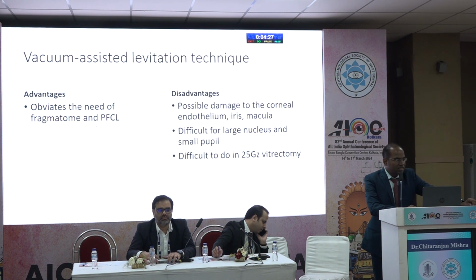So what are the advantages? It obviates the need for fragmatome and PFCL, which is sometimes not possible in a resource scarce area, especially where I am working in a very remote part of Odisha. There we can do with this technique without the need of fragmatome and PFCL.